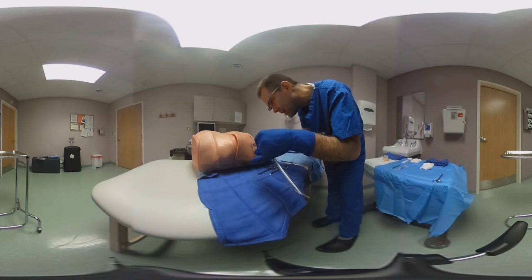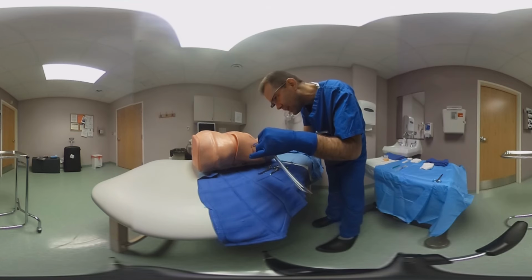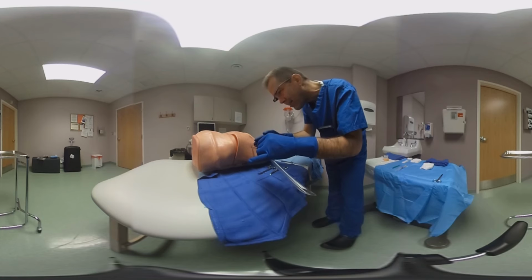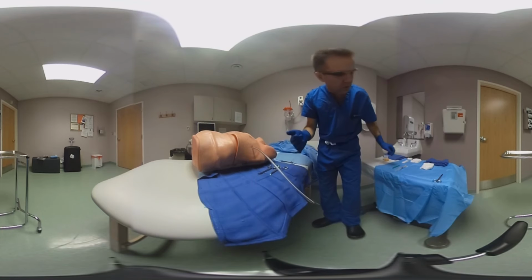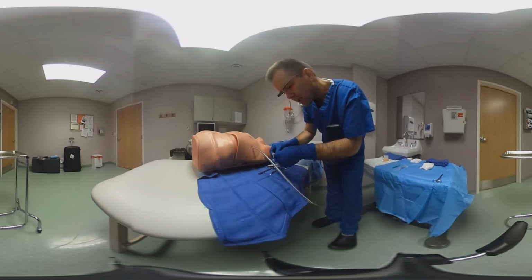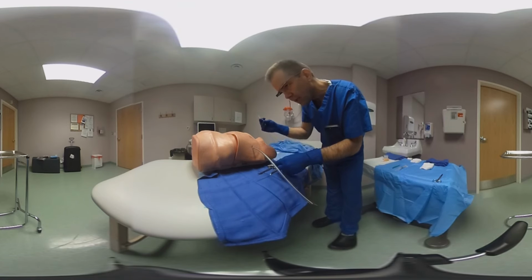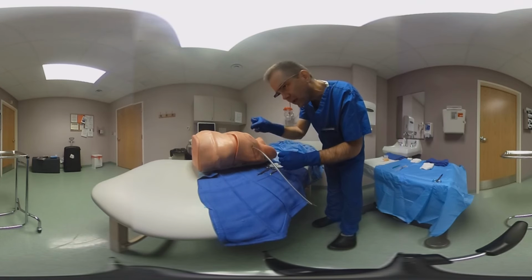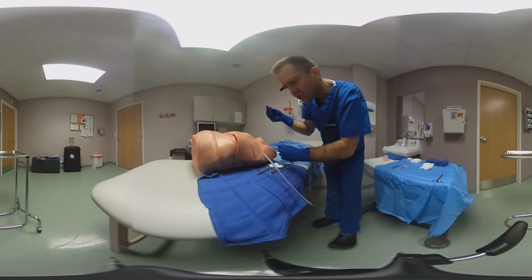You select the adequate length of the tube inside the chest cavity by looking at the numbers, knowing again that the numbers start at the last hole. You want to have that one hole inside the pleural cavity, and then you basically secure the tube. There are many ways of doing this, but one easy way is to use a suture material on a Keith needle, and the Keith needle is a straight needle.